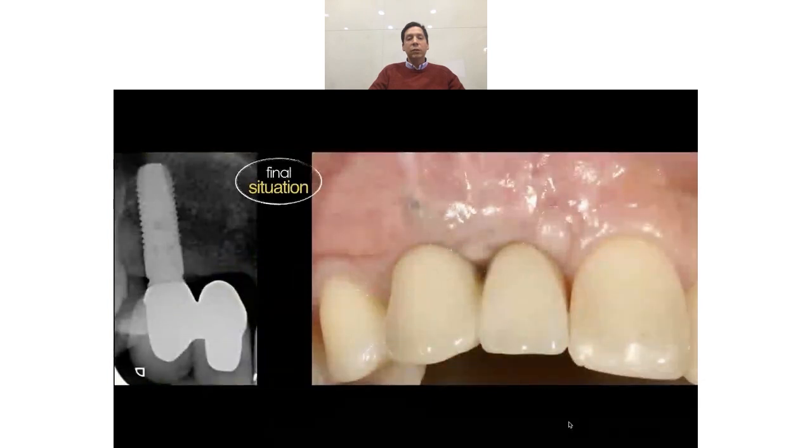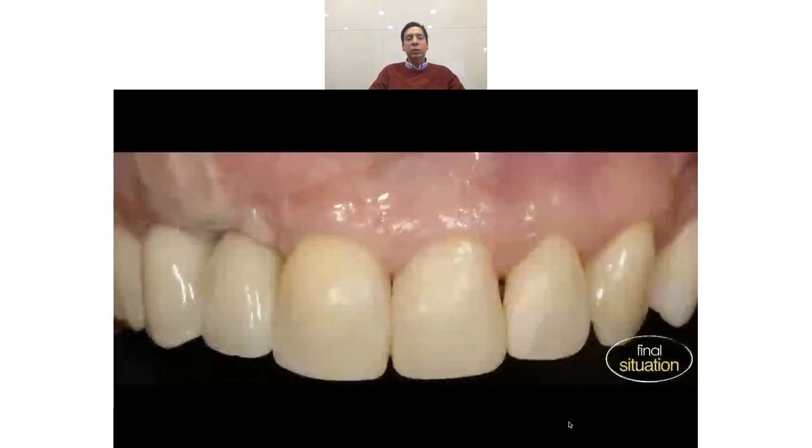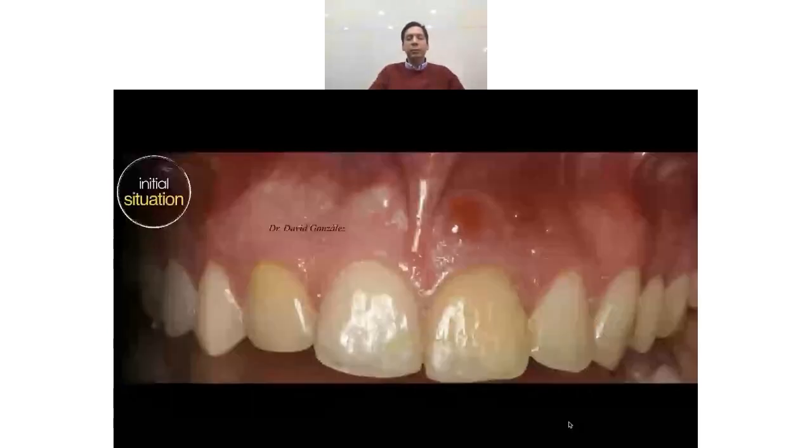This is another view. Look at the bone, it's totally integrated. And this is the final result. With symmetry, I asked the patient to reposition the mucogingival line, but she was tired of surgery. She said she had suffered too much, so she didn't want any more surgery. So that's the final result. We can see the symmetry there.